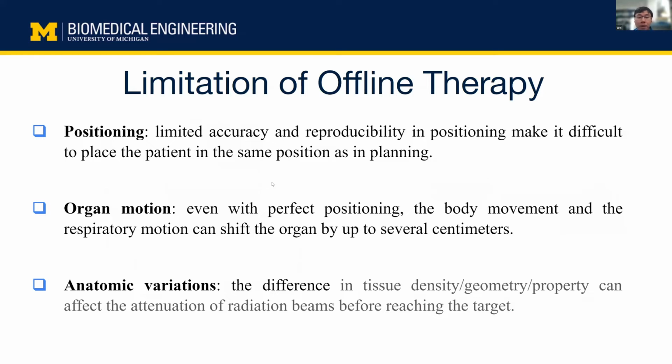For offline therapy, there are several limitations, such as positioning. Before the therapy, the patient will do a treatment planning. At that time, the patient will lie on the treatment bed so that it can be used to locate the tumor. But each treatment has several fractions, which means the patient needs to be under therapy several times, which has limited accuracy and reproducibility for positioning, and it may be very difficult to place the patient in the same position as in planning.